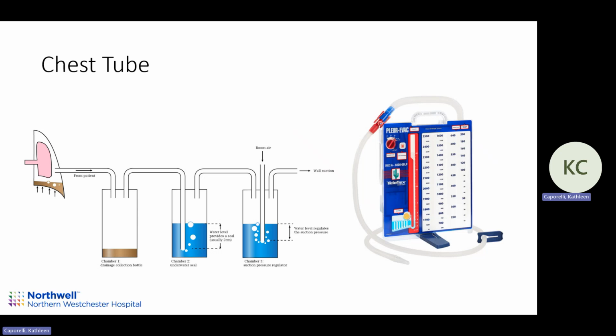And there's usually fluid in there, and there's usually a little white ball that rests on top of the fluid. Okay. And so any air that leaves the patient and goes through will push this little ball down, and you'll see the ball and the fluid drop, and then you'll see a little bubble. And that's what we call an air leak. So if you have them cough and you don't see that ball drop all the way down and the fluid level drop all the way down and a little clear bubble of air go through, that's not actually a leak.